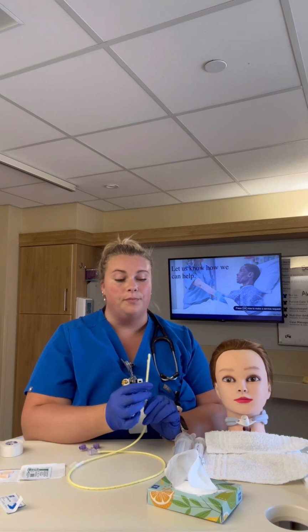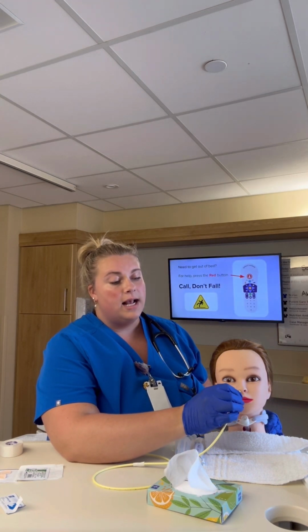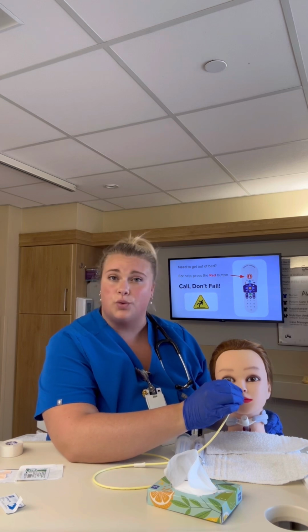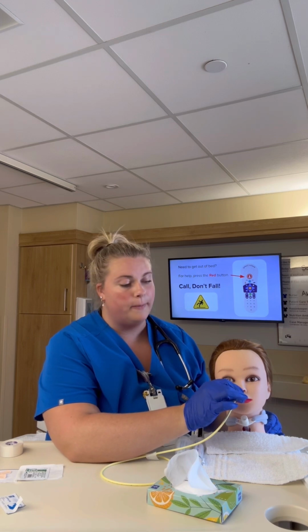We're now ready to insert our NG tube. You are going to gently insert at the naris. If you feel resistance, you're going to pull out and try again. If you're not feeling resistance, you can continue to insert the tube.